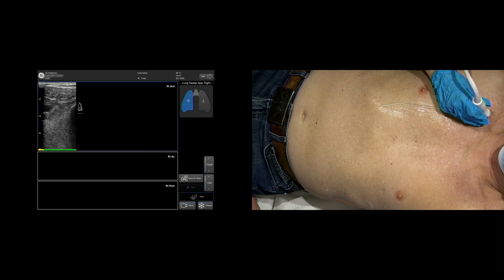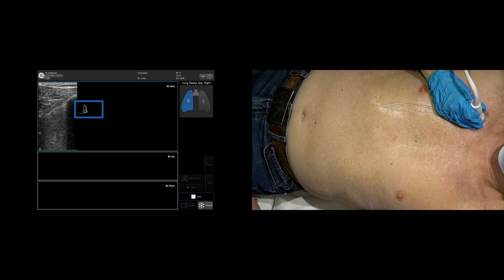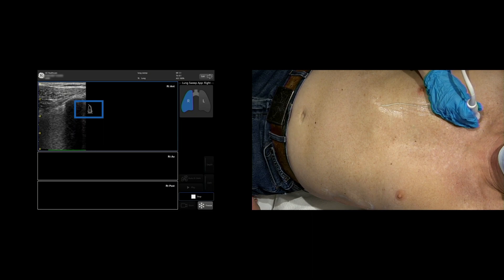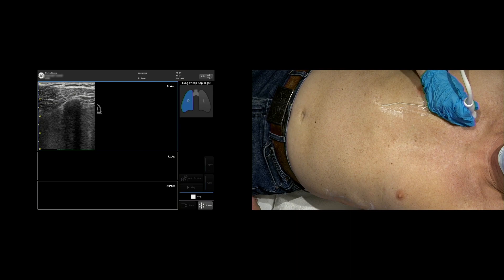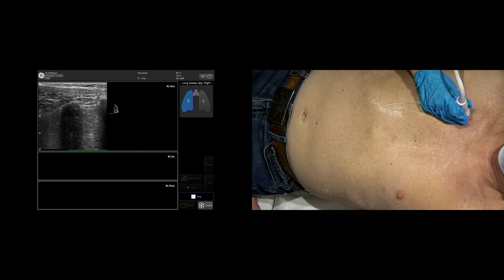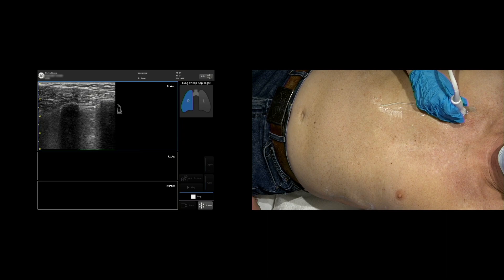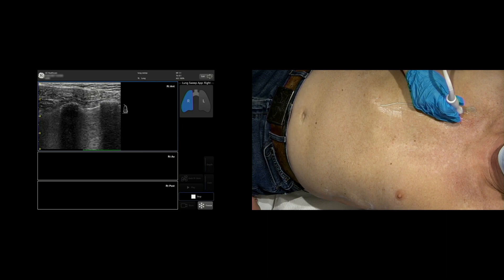Or lift the probe and place it back down on the patient's body again as shown by the probe icon. This allows you to start the sweep without touching the system. Move the probe along the patient's body to perform a sweep of the lung.